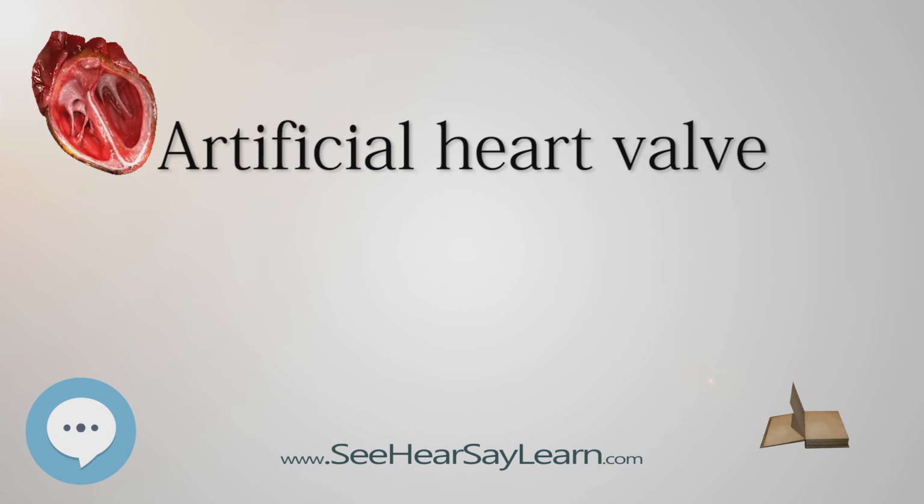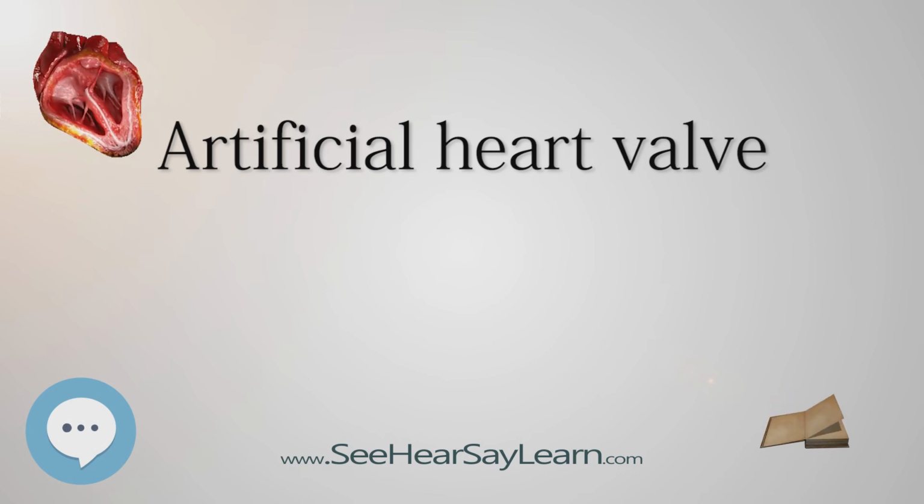Bileaflet valves do, however, provide much more natural blood flow than caged ball or tilting disc implants. One of the main advantages of these valves is that they are well tolerated by the body. Only a small amount of blood thinner is needed to be taken by the patient each day in order to prevent clotting of the blood when flowing through the valve.